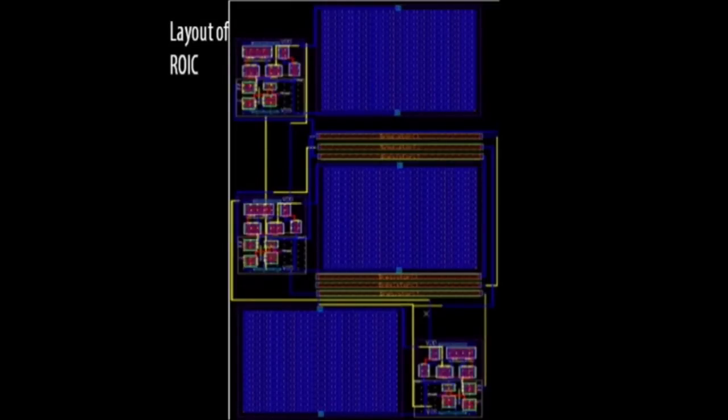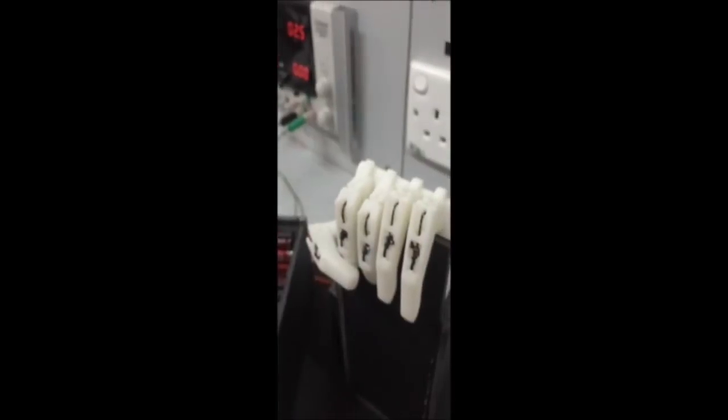What is being shown now is the layout of the ROIC circuit. This is the initial state of the sensor. When bent upwards, this is the resulting gesture. And when bent downwards, this is the gesture produced. Thank you.